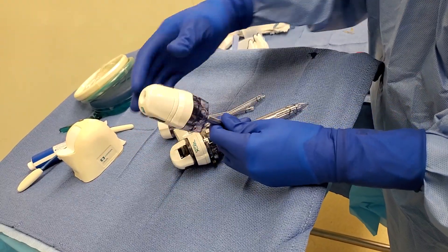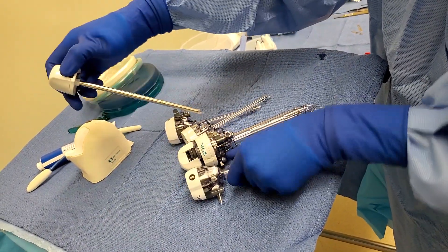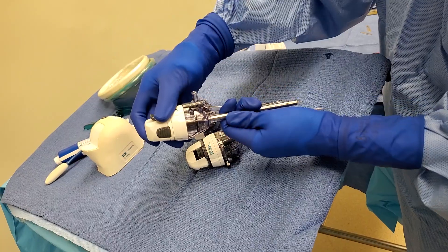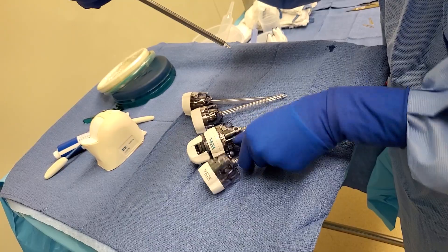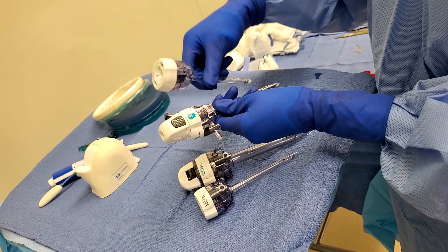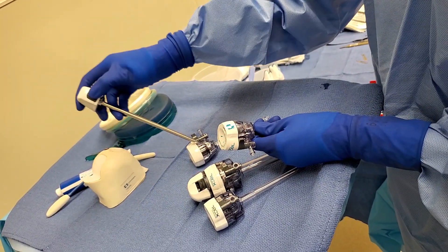When you have an obturator like this, you don't need to open another one to accommodate the other trocars. You just need one of these to guide it in. When it's inside the belly, they take this out and reuse it for the next one. Technically, they're going to use this obturator three times because there are three 5mm trocars.